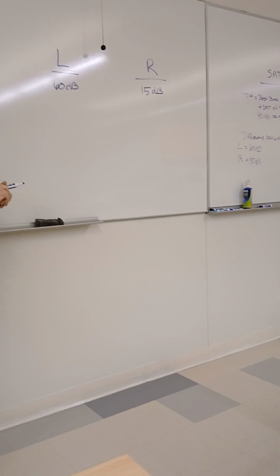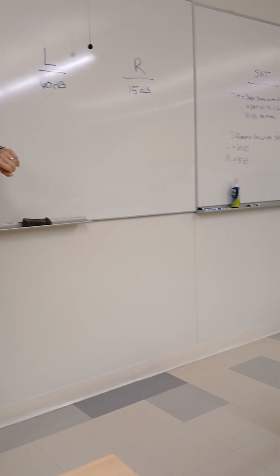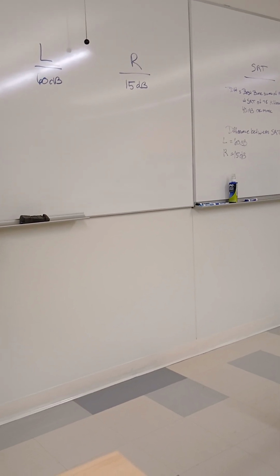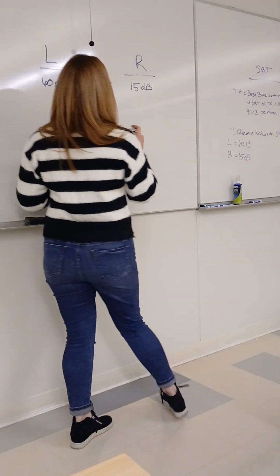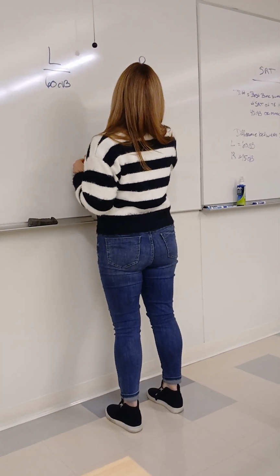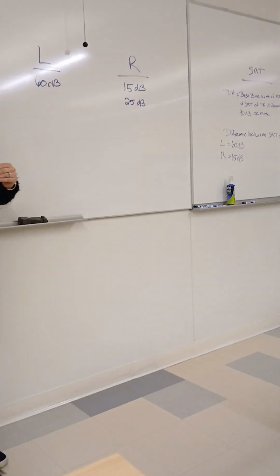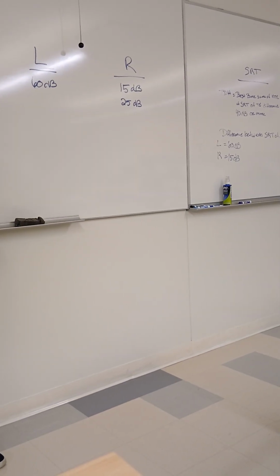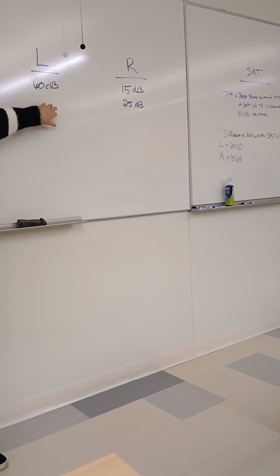What is our initial masking level going to be in that non-test ear? 25? Yes. All right, and then what would you do next? Is that ascending, descending technique? So you would present at 60 again.